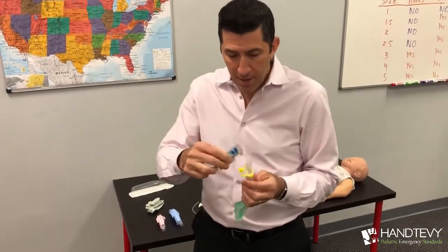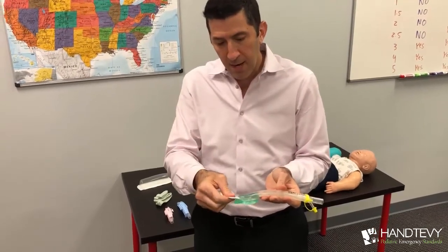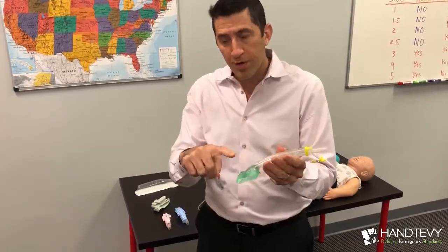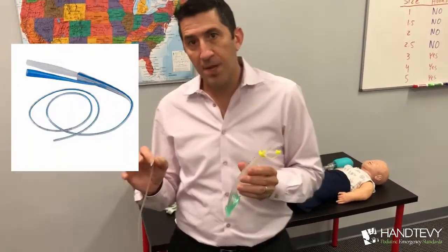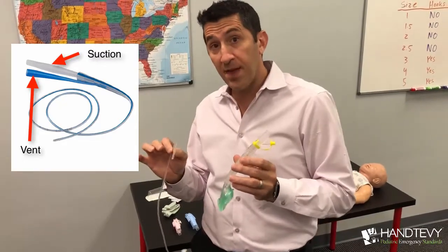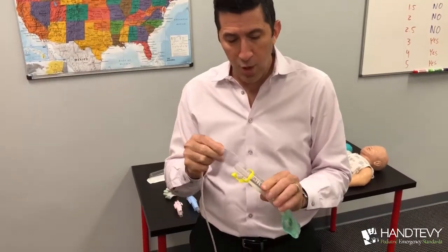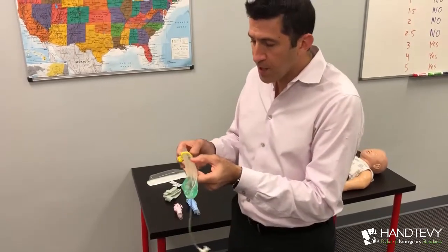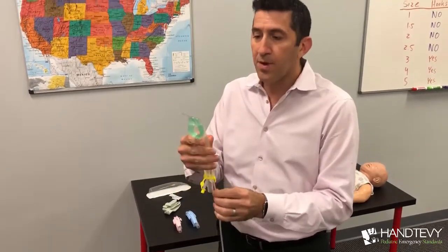The first dollop of lubricant you're going to put on is right over that hole — that's a very important piece. And of course the i-gel itself needs a lot of lubricant right here. Once you have those two lubricants applied, the very next step is to take what I would recommend — a Salem sump. A Salem sump has suction but it's also vented. I'd recommend a 12 French Salem sump. You have to preload this right into that port. Put it all the way through, past the i-gel, just to make sure it gets through, and then bring it back and make it flush.